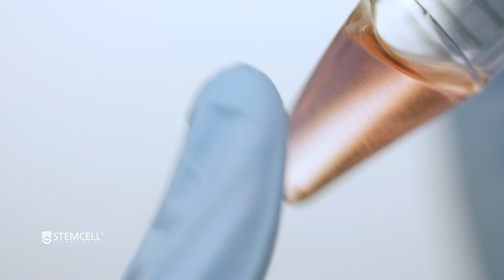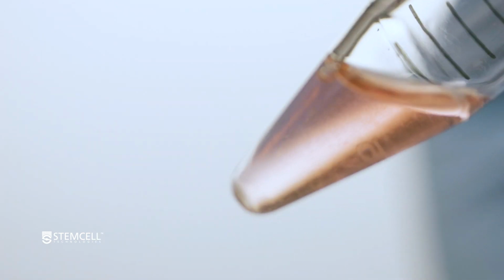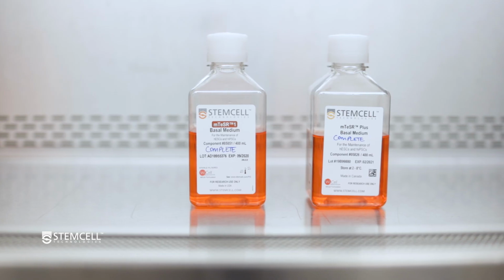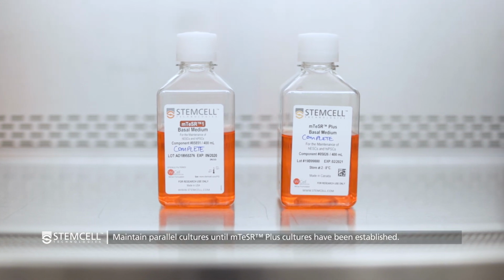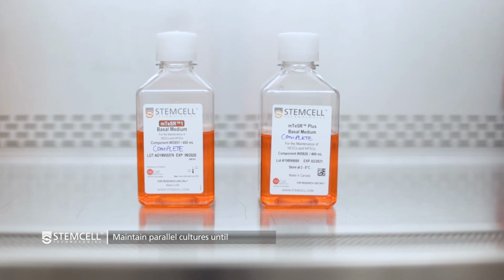Now that you have created a cell aggregate mixture using either ReLeSR or GCDR, it is time to plate them for the transition to mTeSR+. When transitioning from mTeSR1 or other feeder-free media to mTeSR+, it is important to maintain parallel cultures in the original medium until mTeSR+ cultures are established.